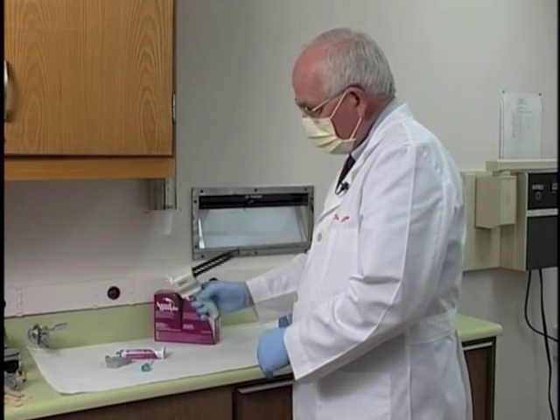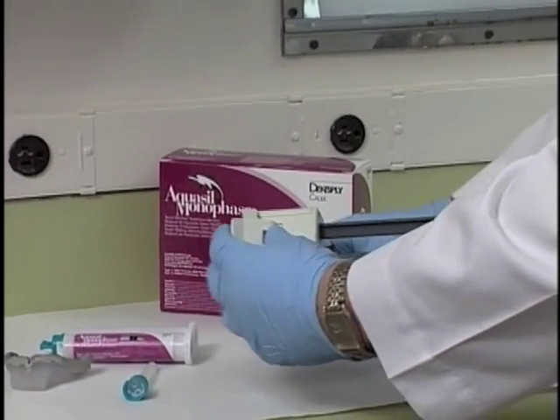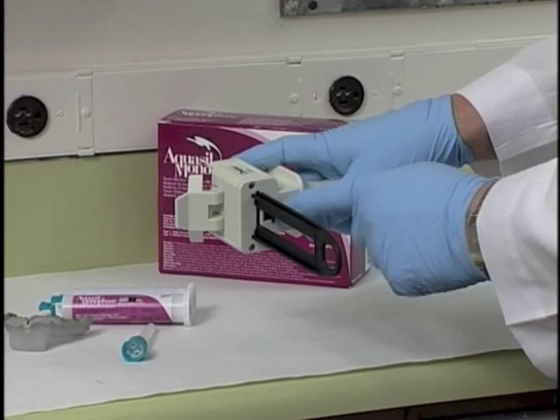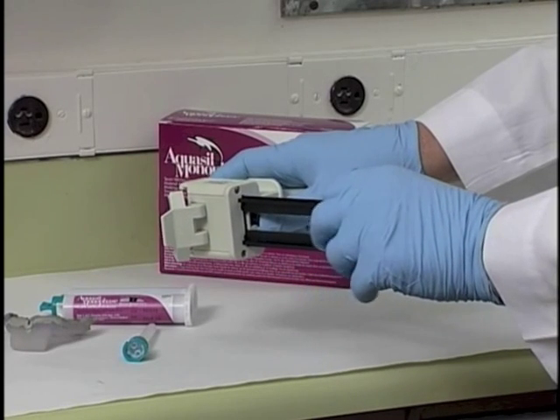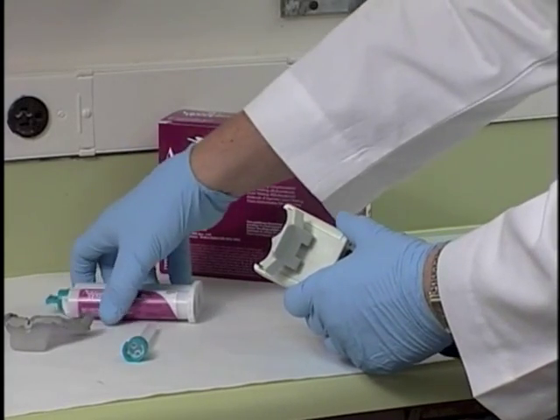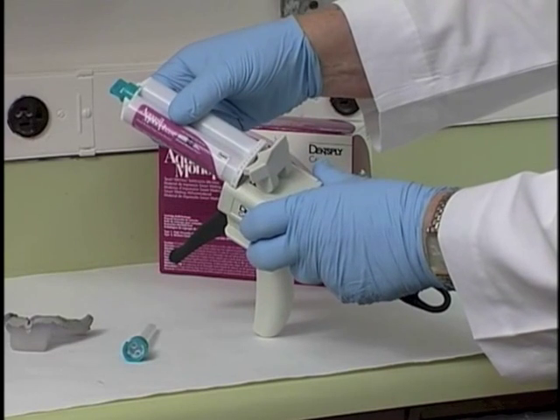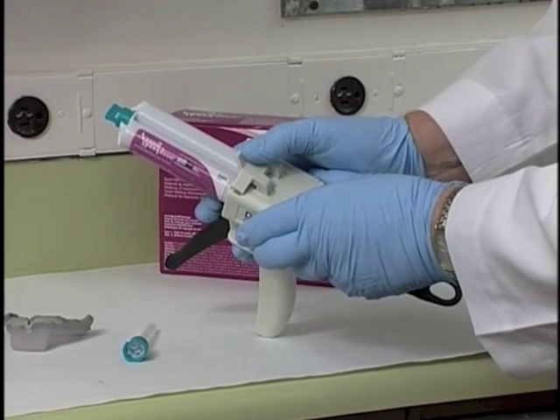The dispenser for the material is a gun-like device, and in order to use it there's a little gate at this point that needs to be rotated up all of the way. There's a little lever at the bottom and underneath the plunger of this gun-like device, and if you push that lever, pull the plunger all the way back. Once the plunger is all the way back, we can load the cartridge into the gun. The cartridge has a little slot in the base of it right here, and that must go down as you load the cartridge. So we load the cartridge all the way into the dispenser, reclose that gate that we lifted before.